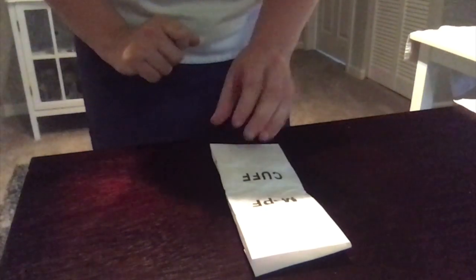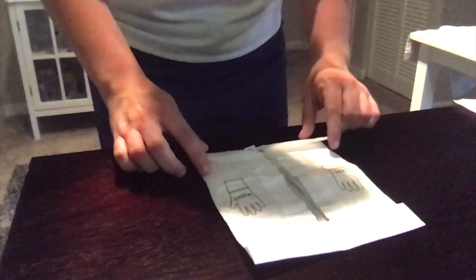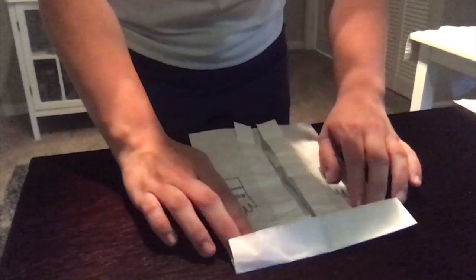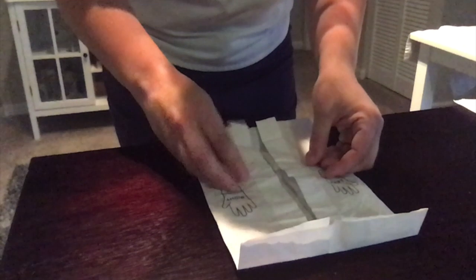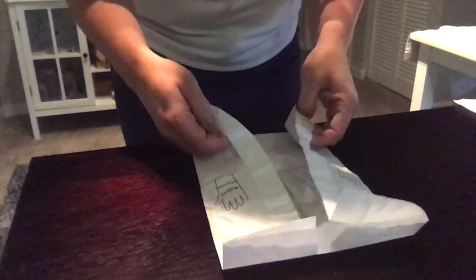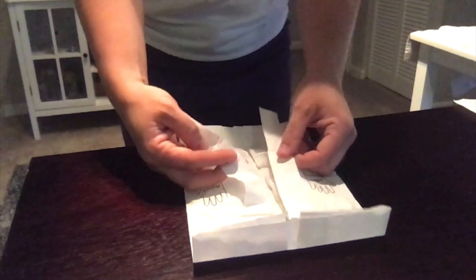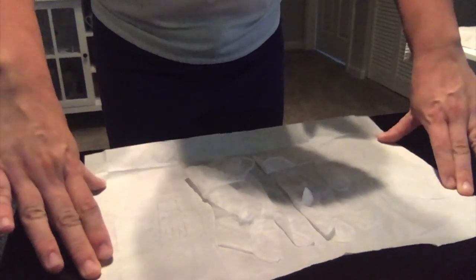So how I'm going to put my sterile gloves on, I'm going to go ahead and open this up. And then these tabs I'm going to flip open so they're nice and straight. Sometimes it's really hard to do. And then these tabs, because all this is 1 inch, so you can touch it, are folded open. And I like to slide my fingers down. Make sure you're not leaning over, so my body is way far away from the table. And I'm trying not to lean over in my field.